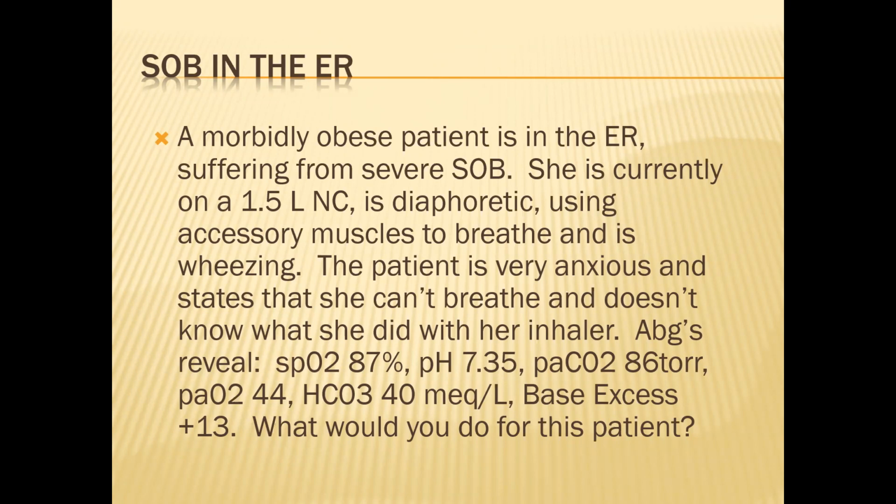Because you don't want to give them too much. Very good. Yeah. So with a Venturi, even if they have a period of apnea, they're not going to get a bolus of oxygen when they breathe in. It's always going to be that controlled FiO2 with a venti mask. So good question. You want to get your saturation around 90% and be happy with that.